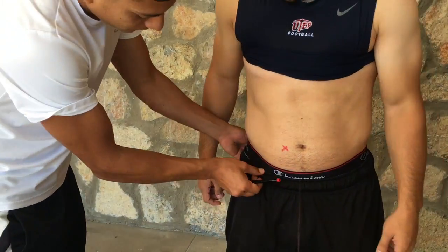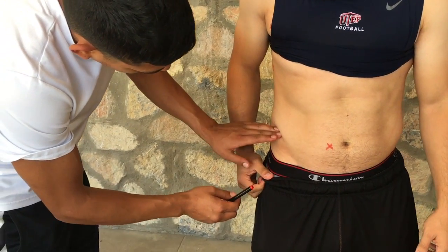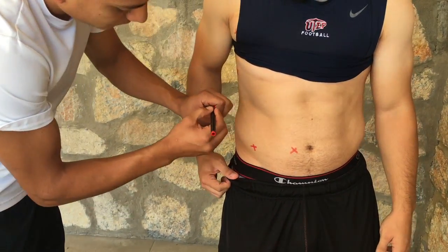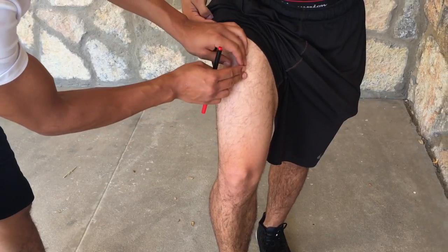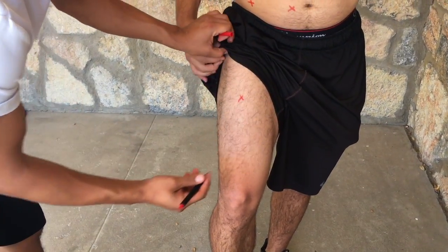You can have the client point to their iliac crest. The suprailiac site is immediately superior to the iliac crest. The thigh site will be located on the anterior midline of the thigh, midway between the proximal border of the patella and the inguinal crease.